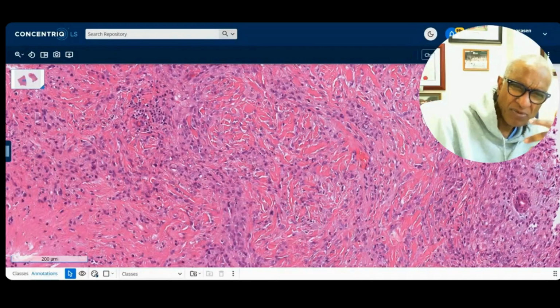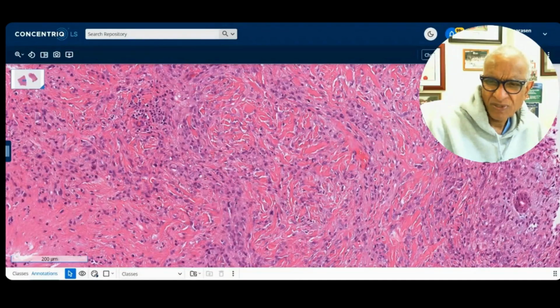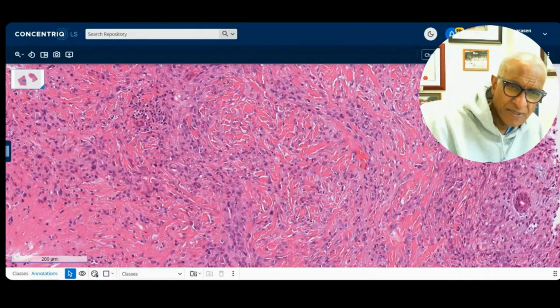So I think you'd probably have to work through it with stains in order to figure this one out. But you guys are smart. You got it out. So that's good. So epithelioid sarcoma, high grade, as you know, comes in two morphological and location types: the extremities, hands, fingers, and then the proximal variety. I've seen more proximal varieties in women around the vulva than in men, but here's one in the scrotum. Just a nice example. Any questions or comments?